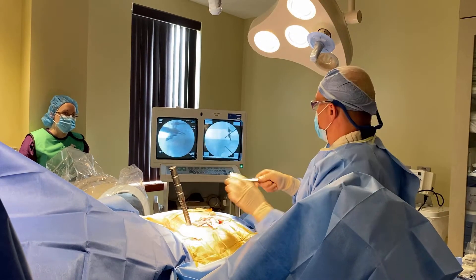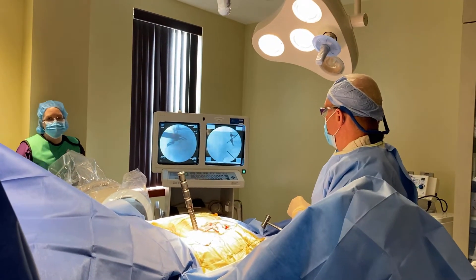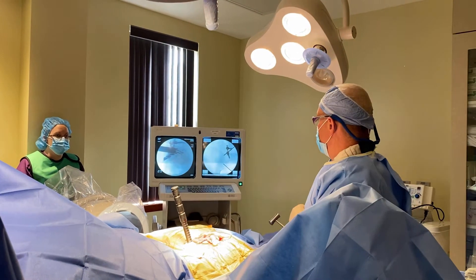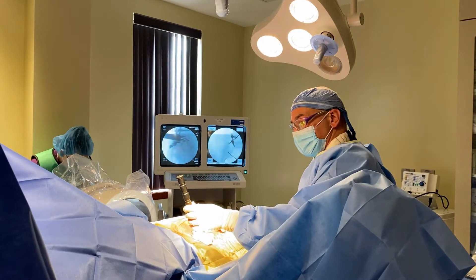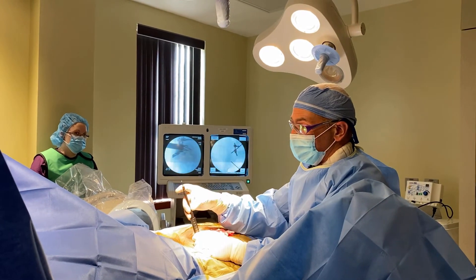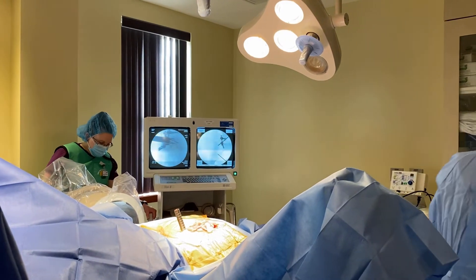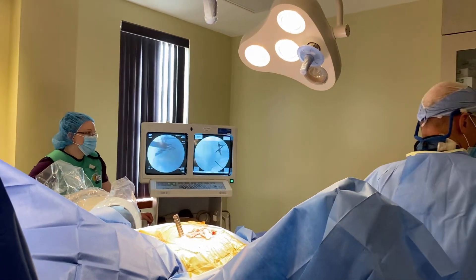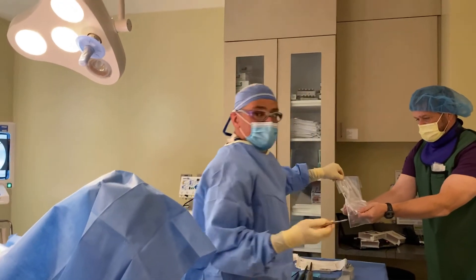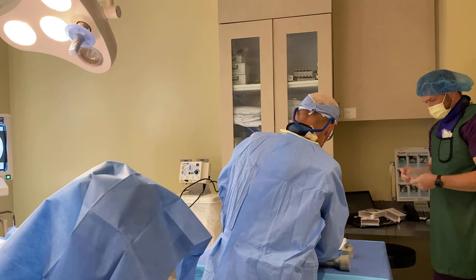There'll be a little bit of pressure for the patient. Now it's nice and solid. We can remove the pin and the joint finder and now have a working cannula for the treatment. Before we drill, we'll take out the graft material, because once you drill it starts to bleed a little bit, so you want to be ready to go with this material as soon as possible.